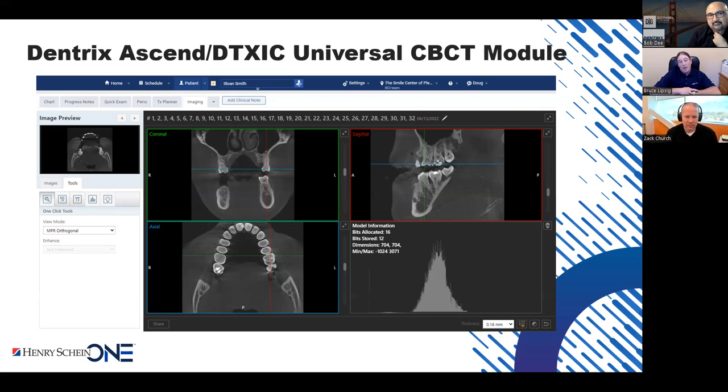But I've also heard the comment of, okay, so now you have three-dimensional imaging, how much of an upcharge is that going to be? And people are really pleasantly surprised when they find out that Dentrix Ascend imaging is a multimodality application that's not going to charge extra because you're looking at three-dimensional images now instead of two-dimensional images. It's all a part of the application. And people were very pleasantly surprised when a new version of Dentrix Ascend appears on the web and they launch it and suddenly there's three-dimensional capabilities. They were very, very pleasantly surprised with that. Yeah, it's a great feature.